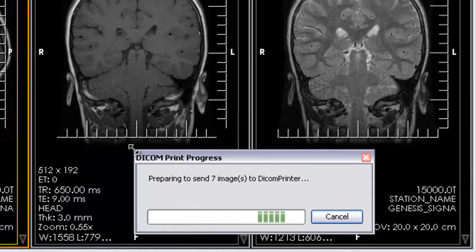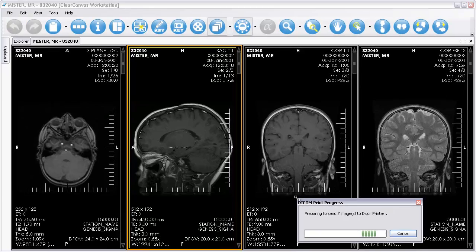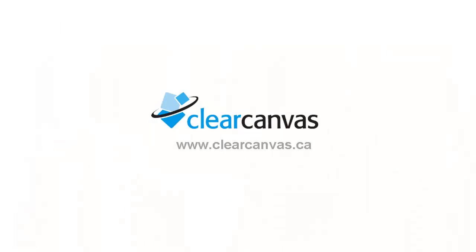That's how easy it is to use Dicom Print with ClearCanvas Workstation.